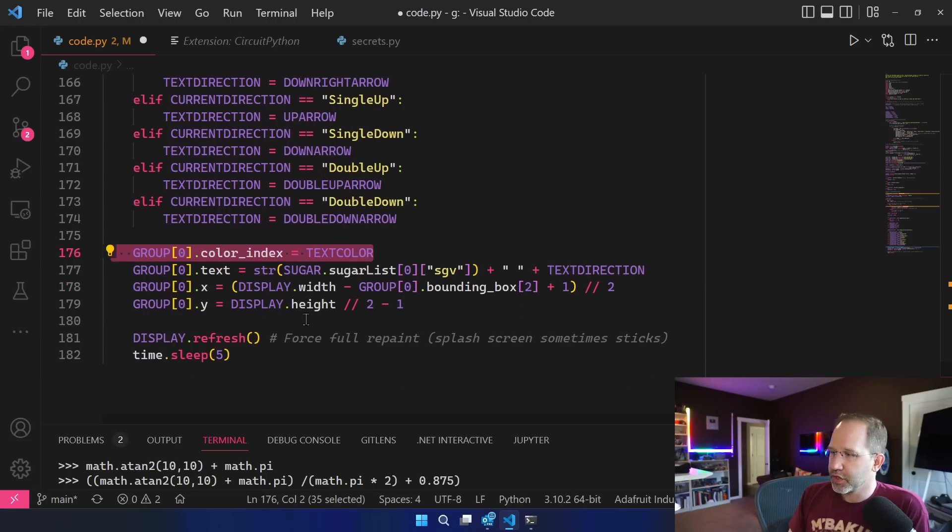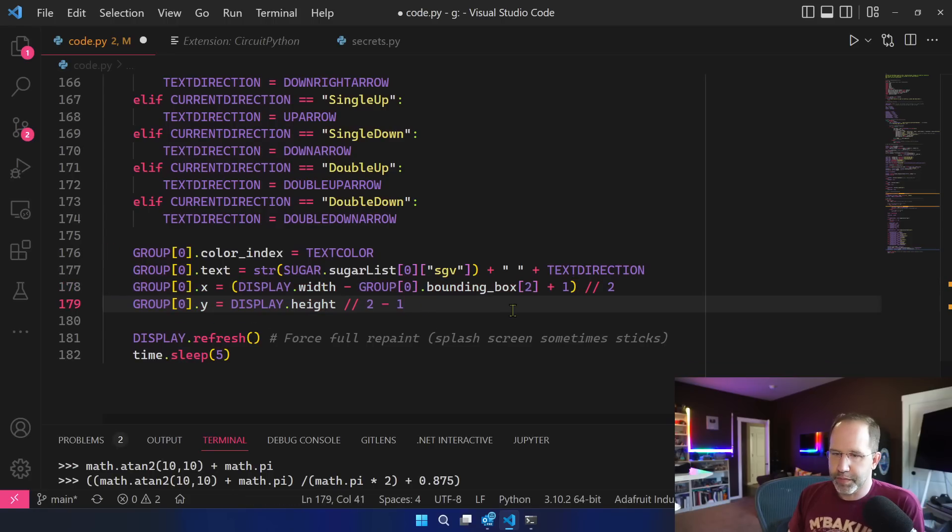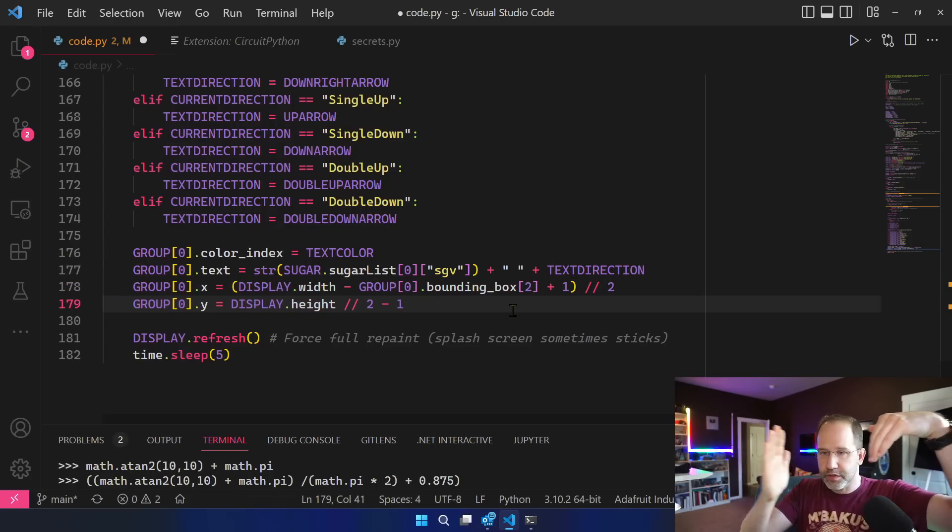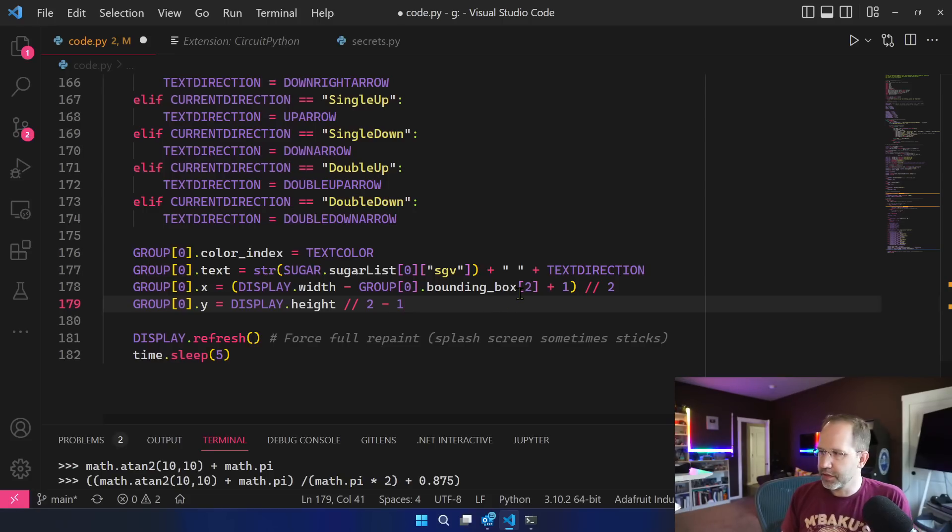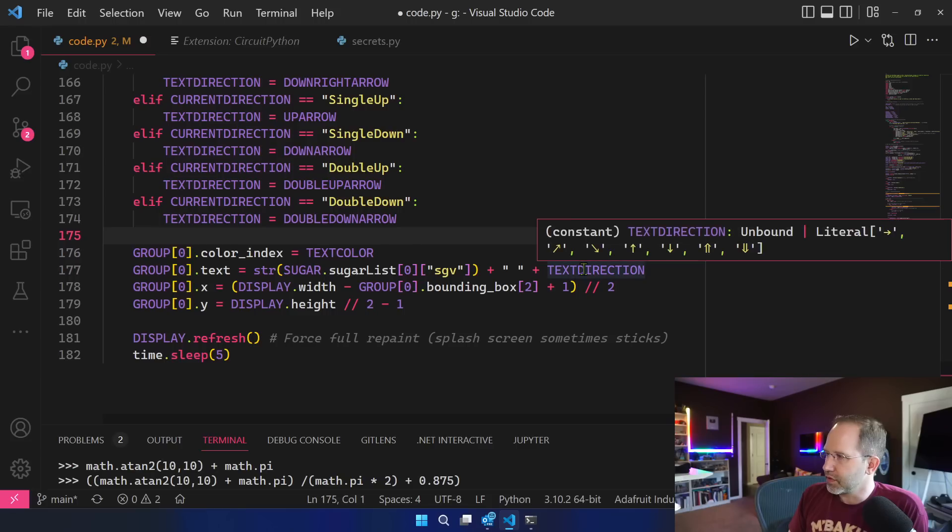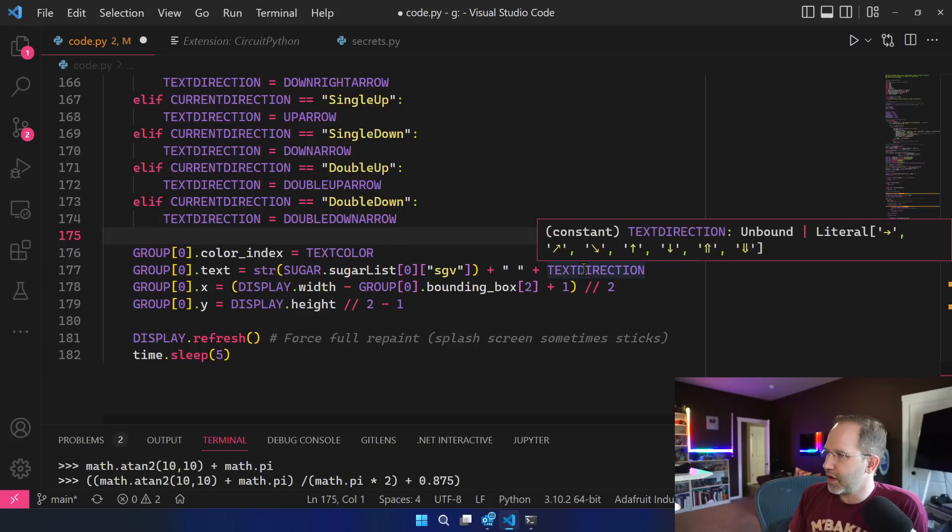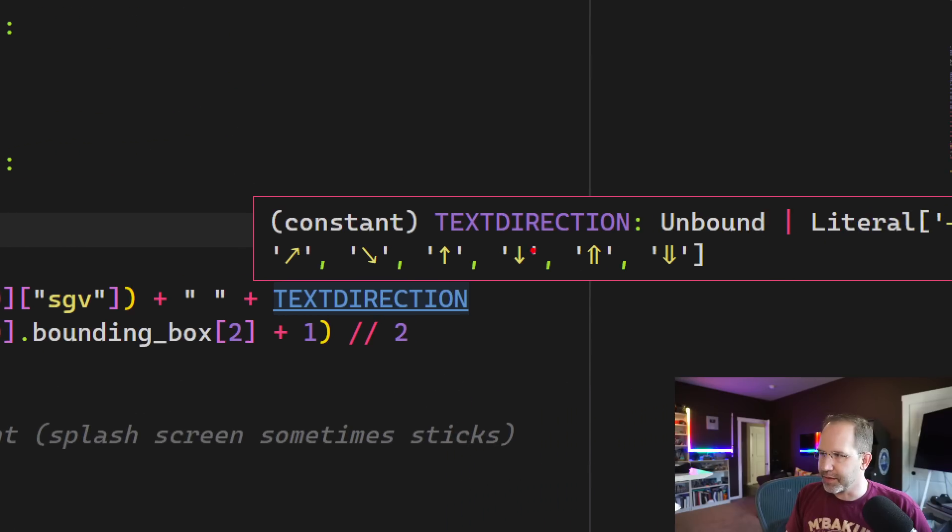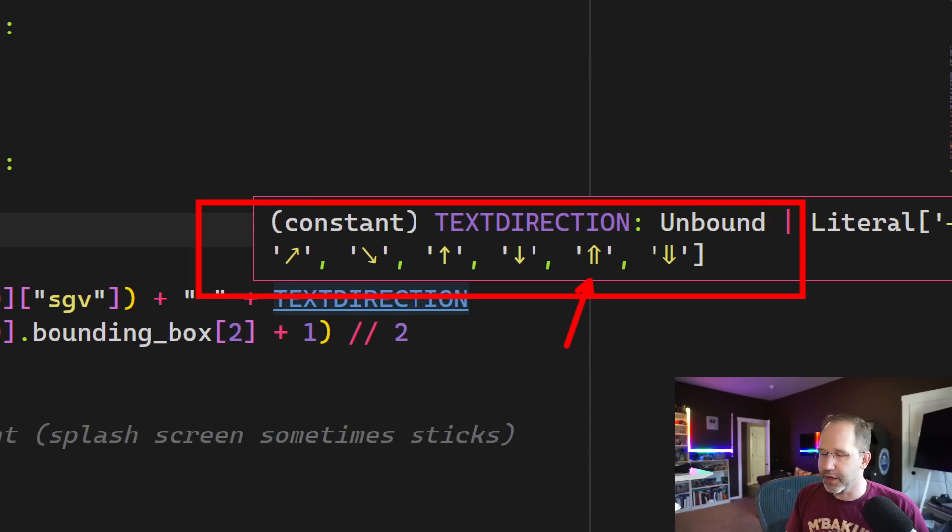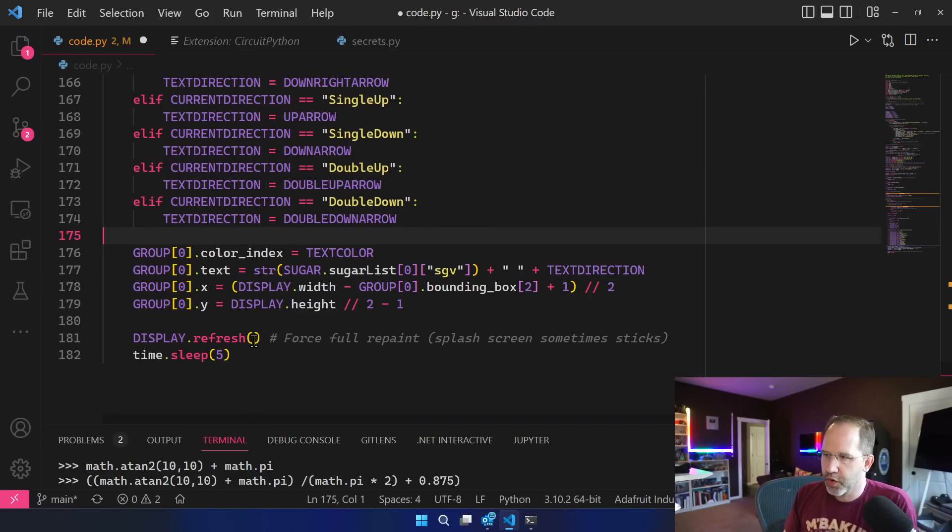And then you can see that I again calculate the width based on the new text. That box is moving around based on the width of the text. And then here this text direction is, look at that. Ah that's beautiful. Look at that constant. I love how Visual Studio Code is giving me a visualization of that Unicode right there so you can see what that would look like. Then I go and repaint the screen. I sleep five minutes and come back later. Is it five minutes or five seconds? Eek.